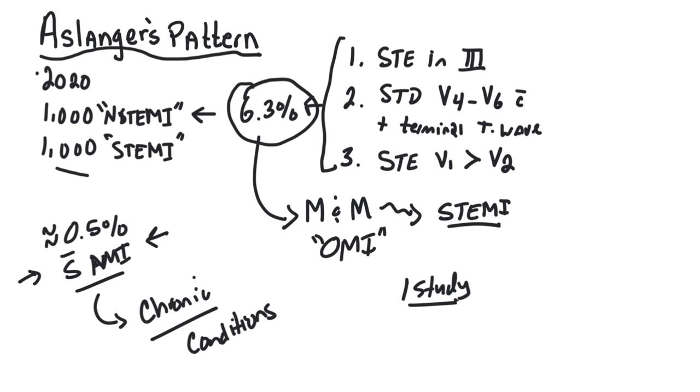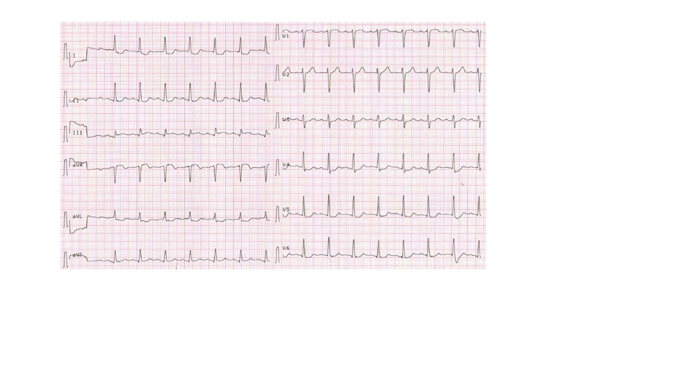Okay, so let's take a look at the Aslanger pattern, and let's just go ahead and take a look at an ECG of this pattern. So here we have an ECG. So again, the major findings are going to include ST elevation in lead 3.